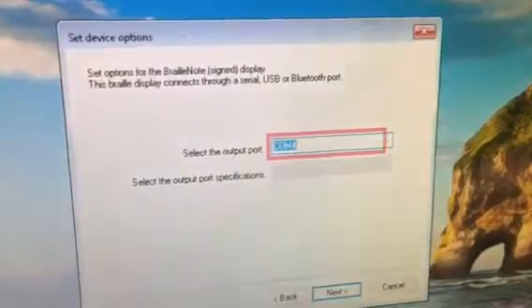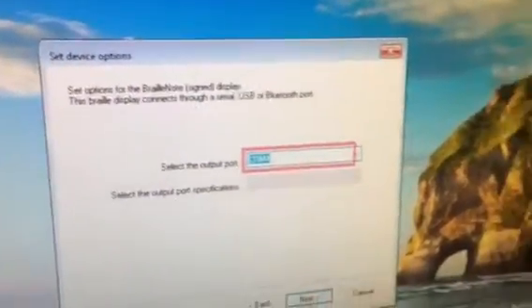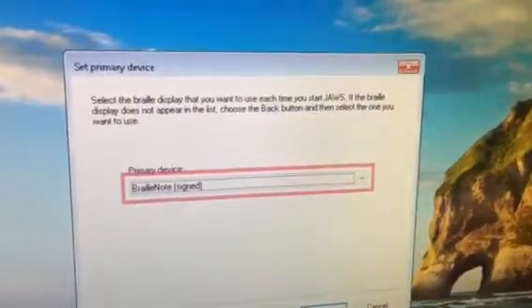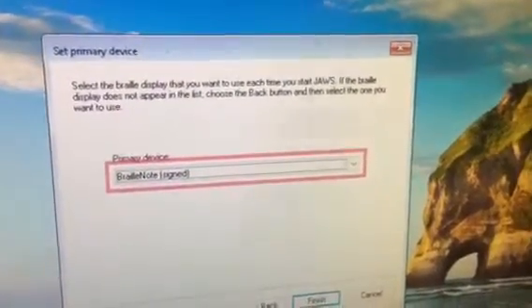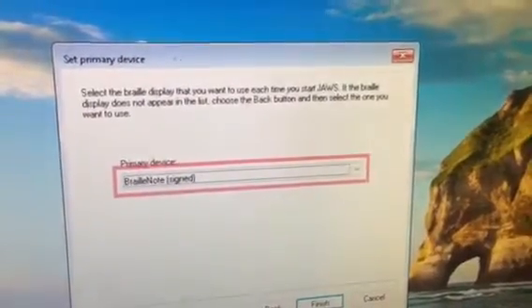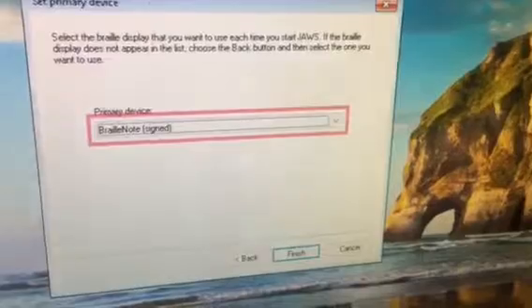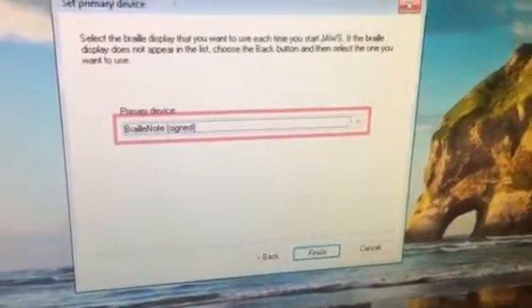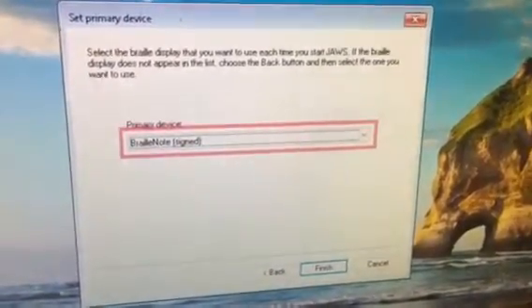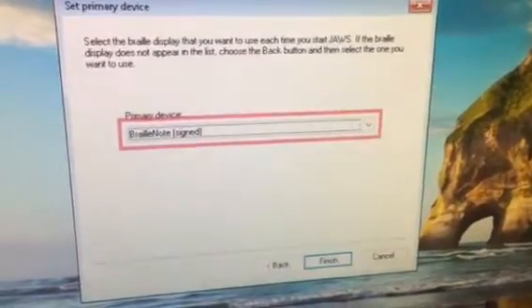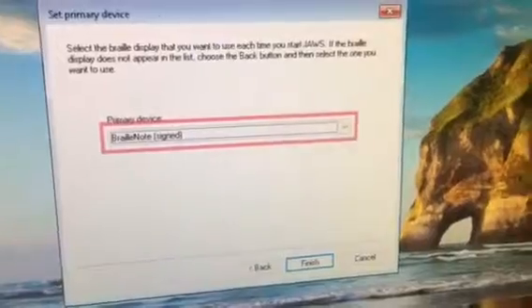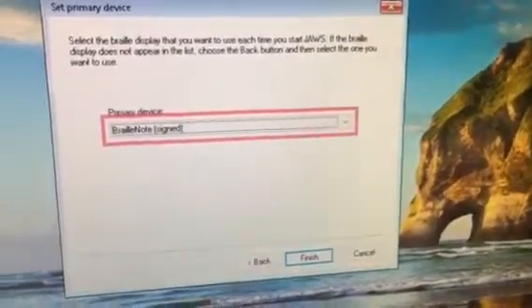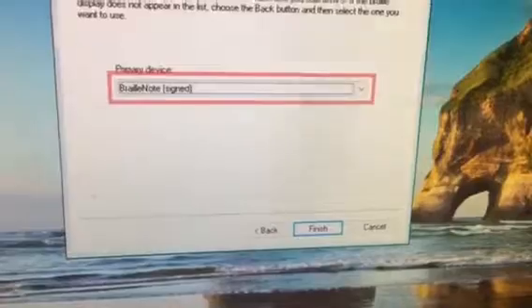Select the Braille display that you want to use each time you start JAWS. If the Braille display does not appear in the list, choose the back button and then select the one you want to use. Primary device: BrailleNote. Now it should say the primary device is BrailleNote because that's what you checked, or whichever Braille display you have. Then you're going to either press Enter or tab to the Finish button and press spacebar.